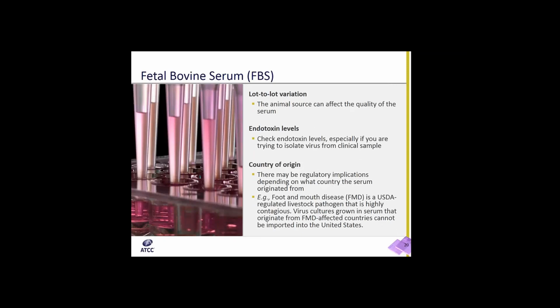Furthermore, there are lot-to-lot variations in fetal bovine serum. The exact composition of serum is unknown, and therefore it is a little difficult to get consistent results unless you are willing to use a particular lot for all your experiments to avoid the differences that may occur because of this variation from one lot of animal serum to another lot.